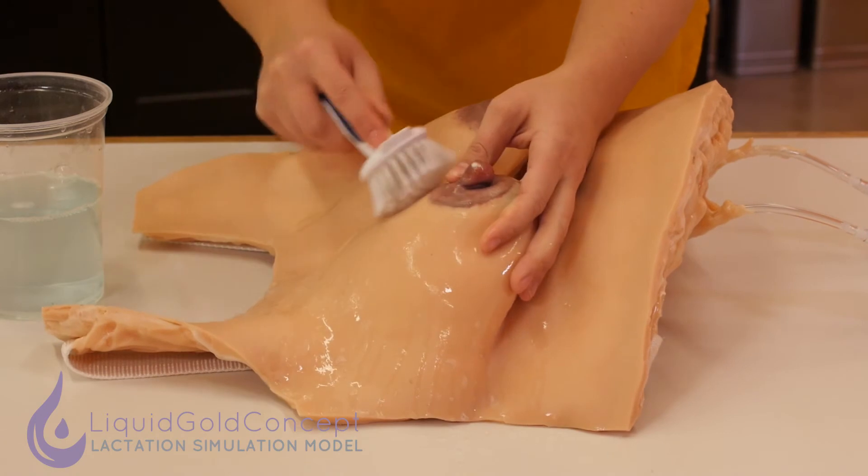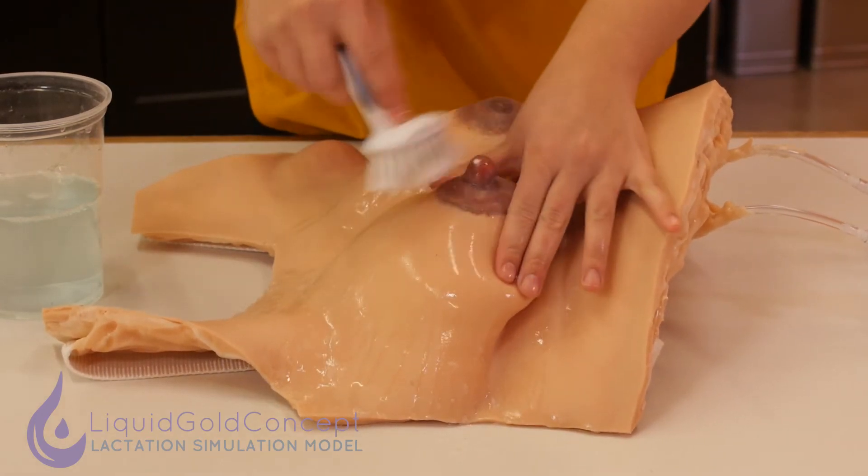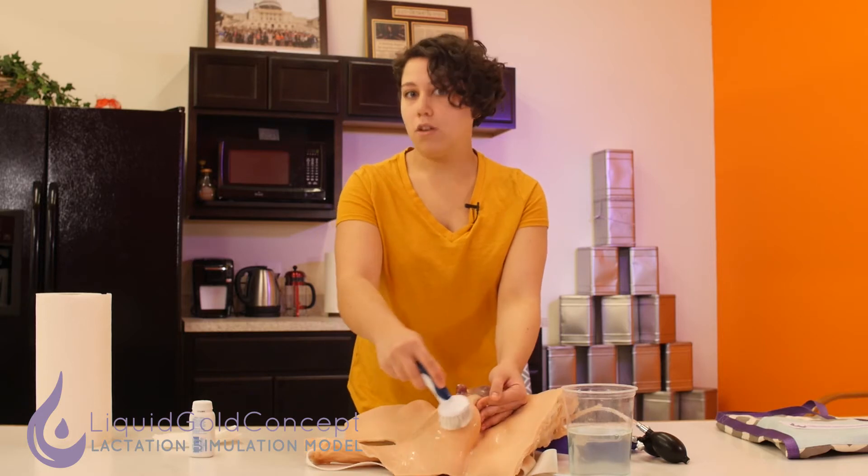Another way you can go about doing this, if you don't have a sink or warm soapy water nearby, is to just use some baby wipes or alcohol wipes, which is also totally fine.